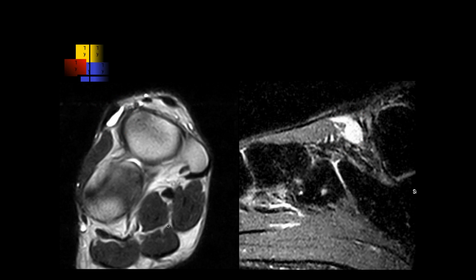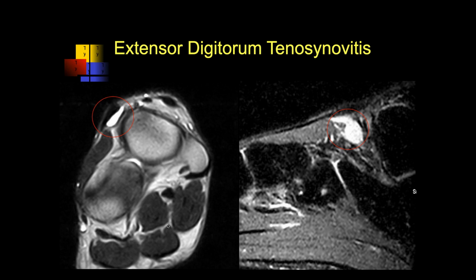Are we looking at the extensor digitorum at this point? There's some fluid underneath it. This might suggest some tenosynovitis. Good. Great. Okay.